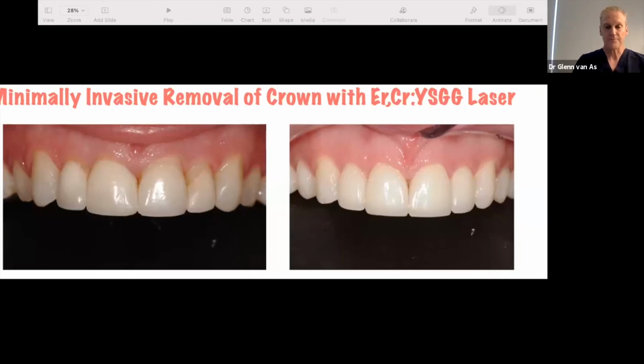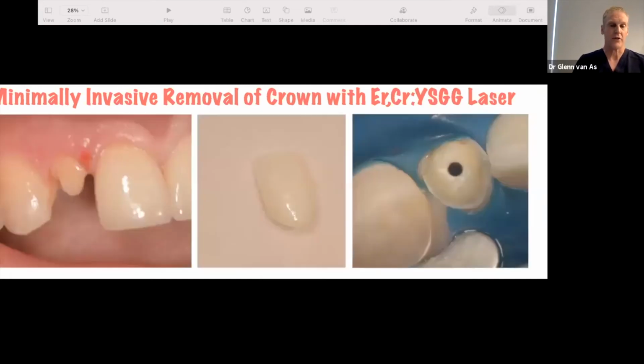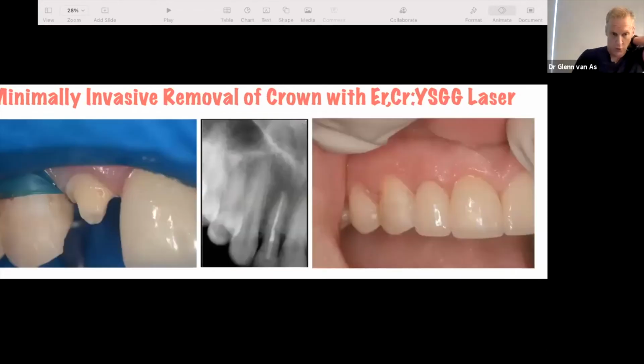In her case, we were able to get the ceramic crown off, as you see in the middle. There's a tiny tooth structure. There's the endo access. Look how small I was able to keep it with the traditional means. I was able to, in fact, put a little post in and use the same crown and cement it back into place. Same color, same one-day treatment, get the crown off, cement it back in. A lifesaver, truly a lifesaver in a case like this.